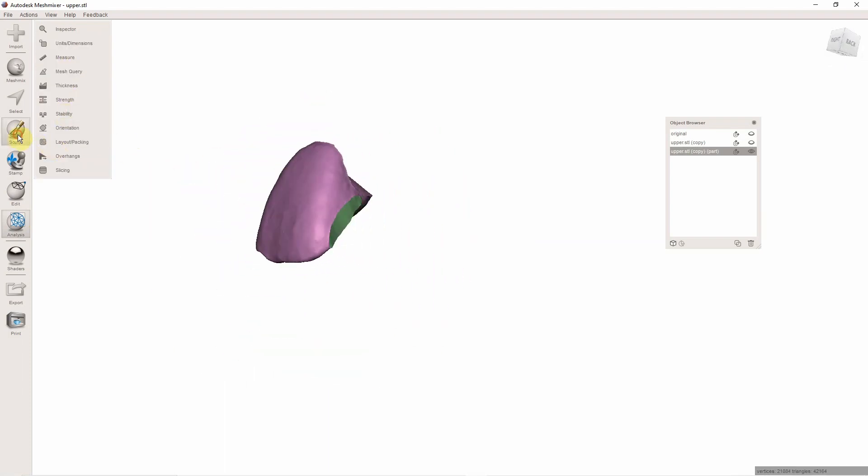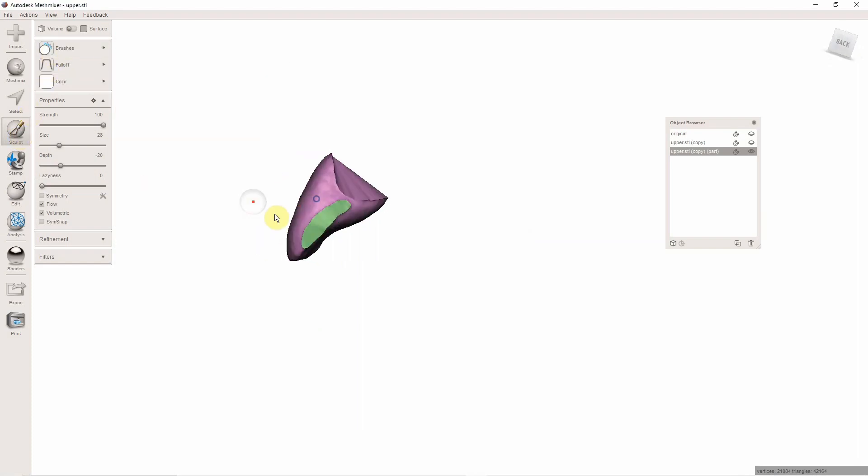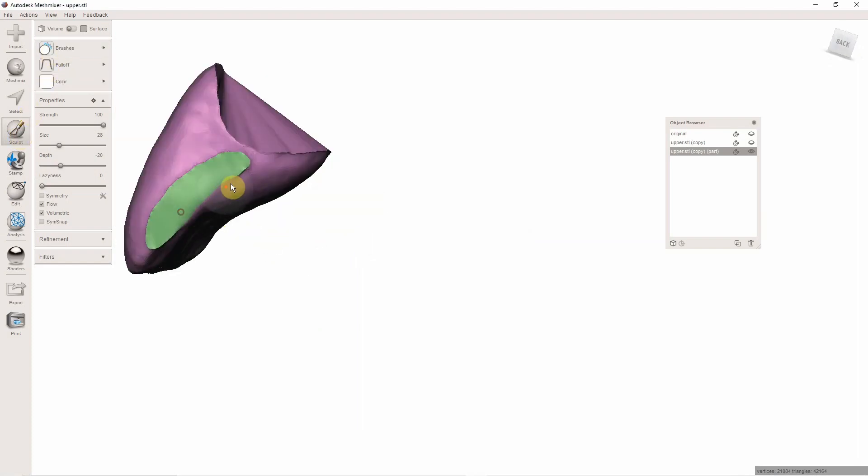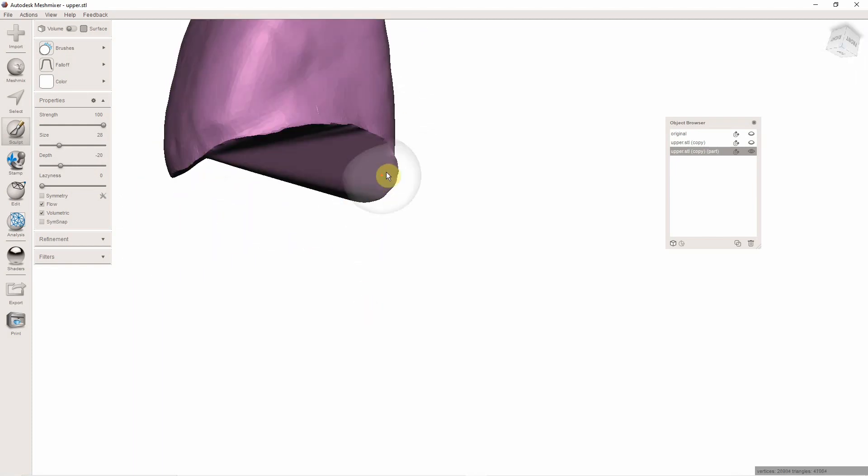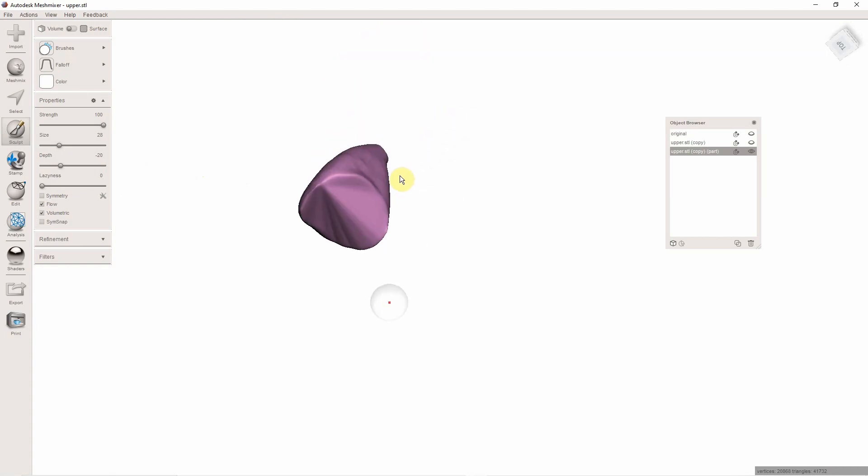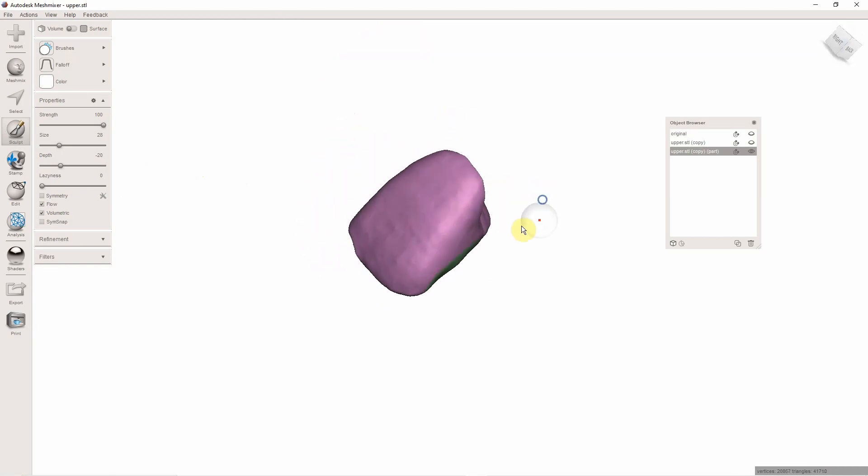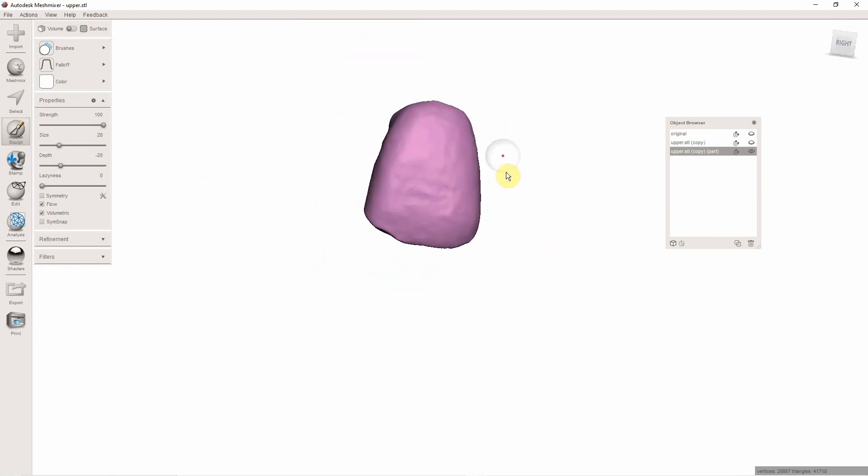Now I'm just going to go to Sculpt, Brushes, Robust Smooth, and I'm just going to smooth. If you guys aren't getting these new face group colors like that green there, it just means that in your settings you don't have Remember Face Groups on. So now I have this cool tooth.